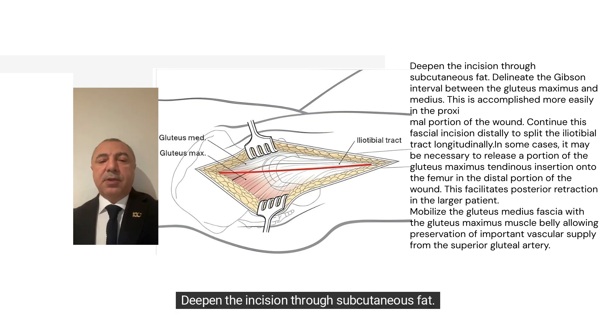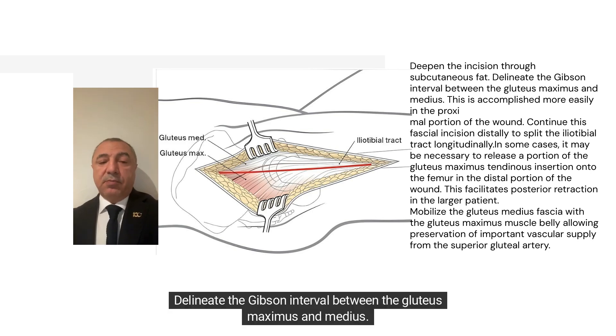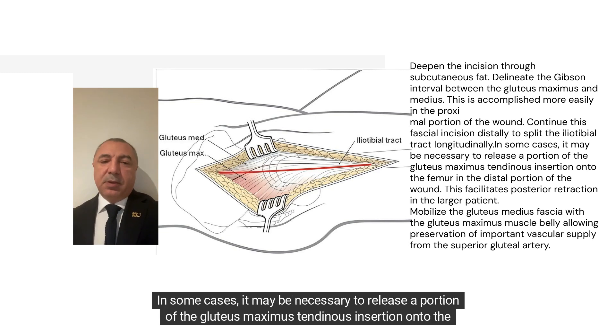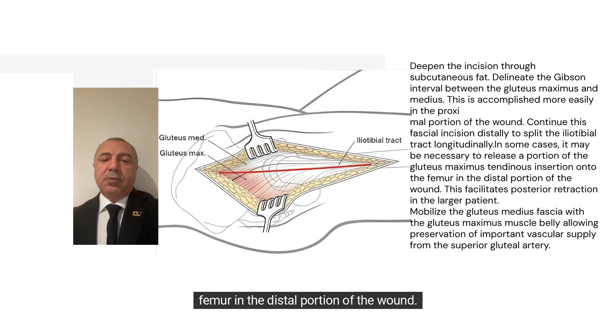Deepen the incision through subcutaneous fat. Delineate the Gibson interval between the gluteus maximus and medius. This is accomplished more easily in the proximal portion of the wound. Continue this fascial incision distally to split the iliotibial tract longitudinally. In some cases, it may be necessary to release a portion of the gluteus maximus tendon insertion onto the femur in the distal portion of the wound. This facilitates posterior retraction in the larger patient.